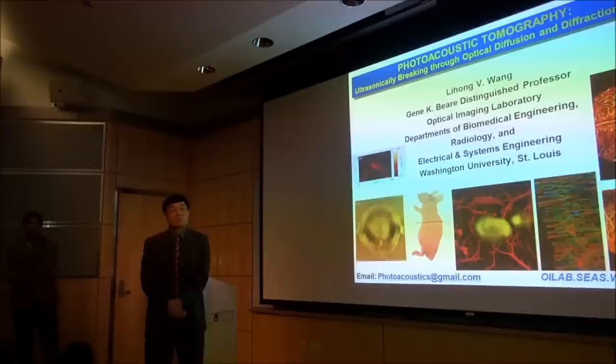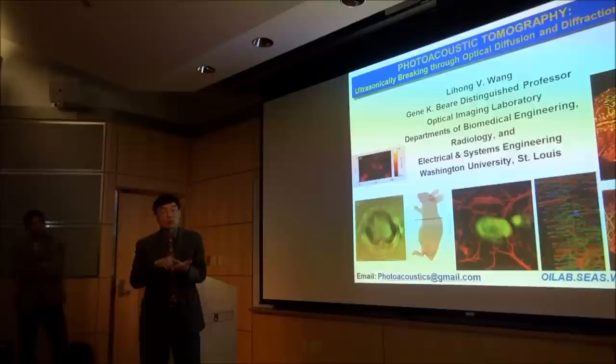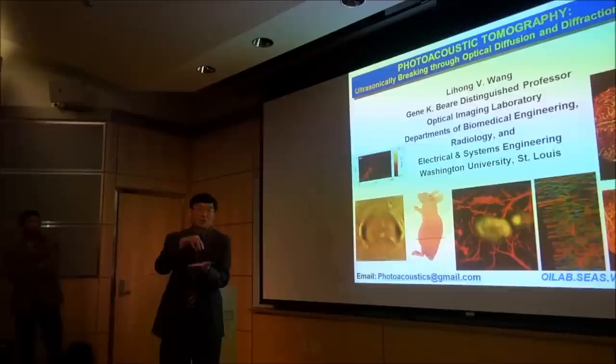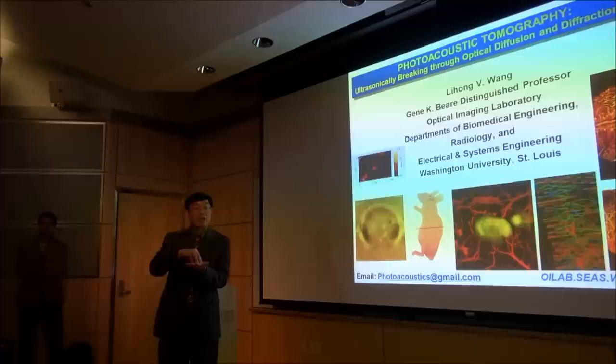Well, this is your skin. Those aren't that stable, are they? Your skin, well, you do have some motion artifacts. But we're scanning these scans at 200 hertz, and this 3D image was scanned at 20 hertz. So you're scanning at almost video rate for the 3D images. You're scanning fast enough. We also stabilize the imaging region, so that's in contact mode. If you have non-contact, you get breathing motion and everything going on. So contact actually minimizes the motion artifact. Okay. And plus, you really need a high imaging rate to begin with.